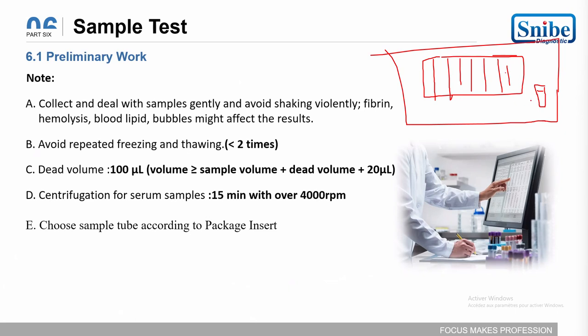The number of tests depends on the frequency of running the quality control, of course. It is enough to run the 7 tests.